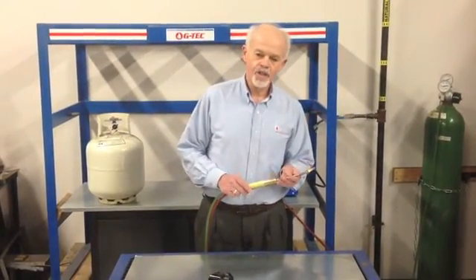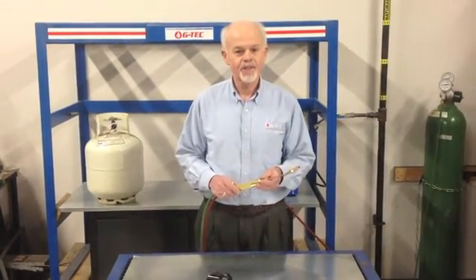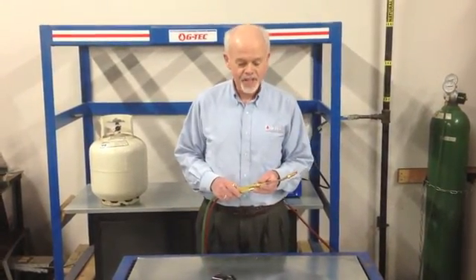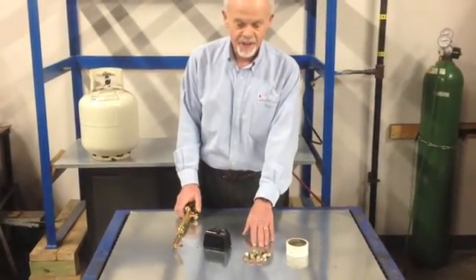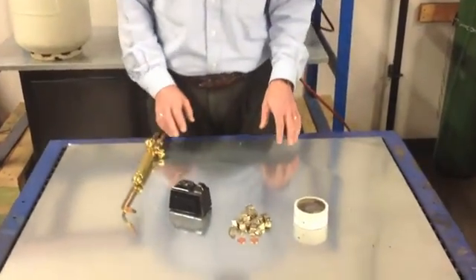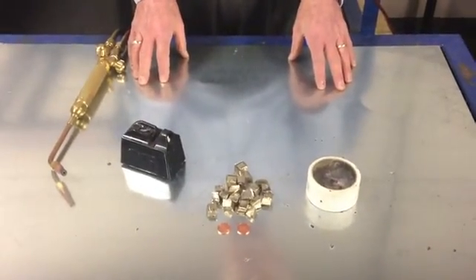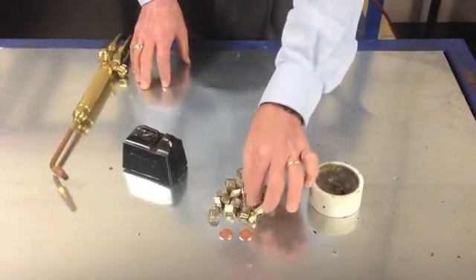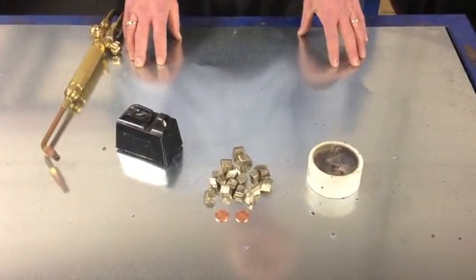Now, unfortunately, our budget doesn't allow for melting gold, palladium, cobalt, or other metals that you use. So what we're going to use are some bronze nuggets here for doing our casting. These are the kinds of things that are used for students in jewelry schools, and perhaps you used something like this in school too. If you look, you see we've got some pennies there to give you an idea of the size of this.